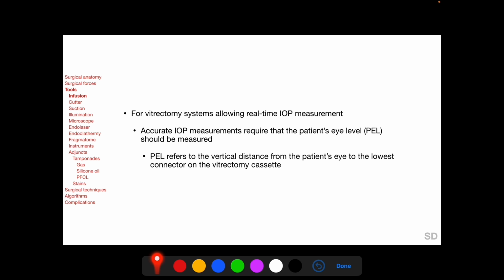Common instruments used during vitreoretinal surgery include scleral indenter, extrusion cannulas, which we will be discussing later in this session, a variety of forceps such as end gripping, ILM, max grip, asymmetric, serrated, pick and IOFB forceps, and scissors such as horizontally curved scissors, straight scissors and vertically curved scissors, and probes such as endoluminator, diathermy and laser, which we have discussed.